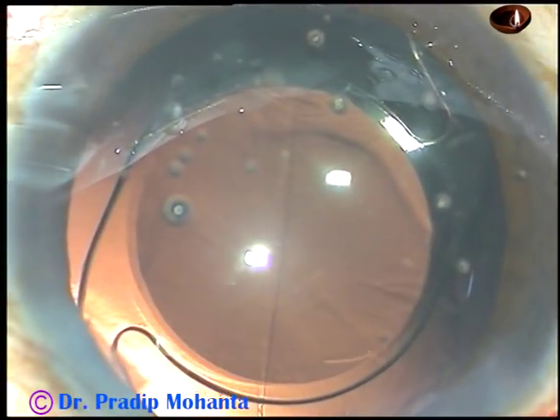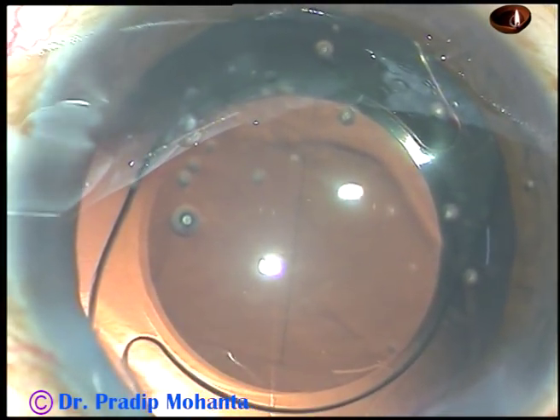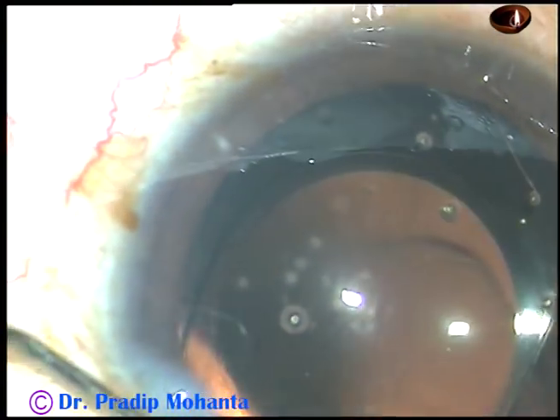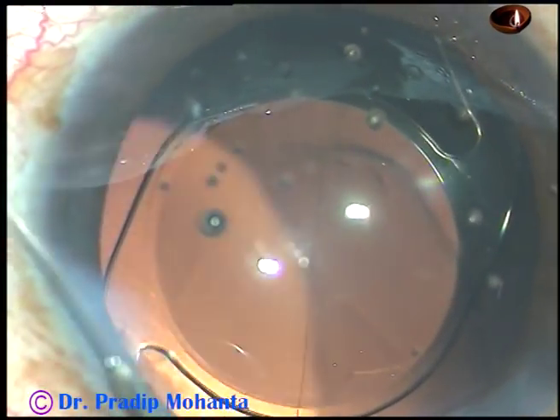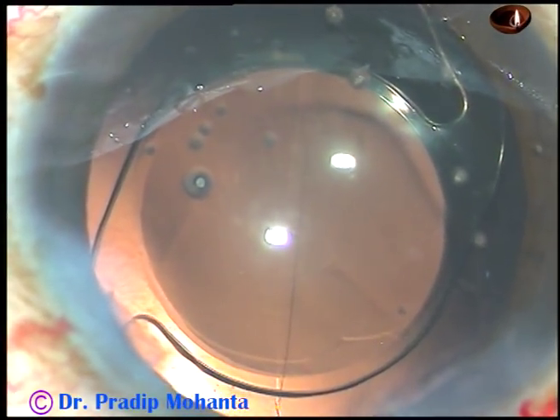This is a bit of moxifloxacin. You just have to close only one side port. The stroma on either side of this side port is closed by stromal hydration.